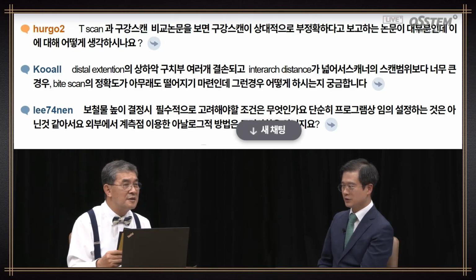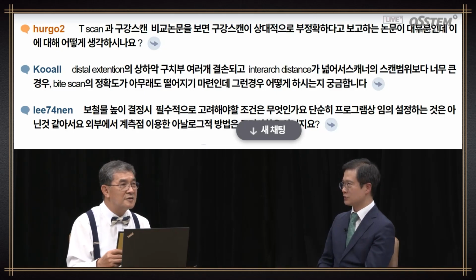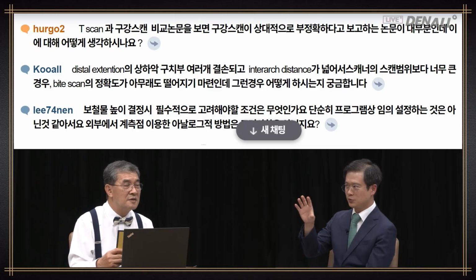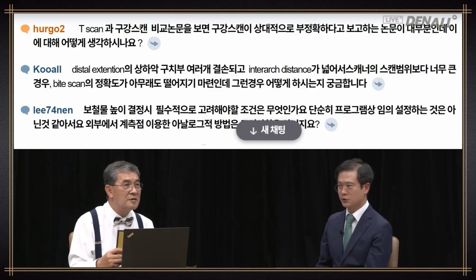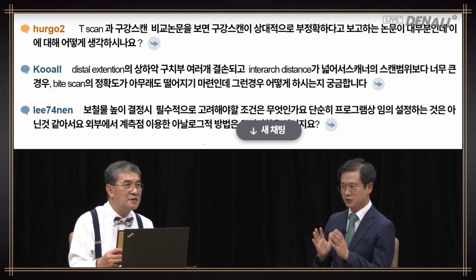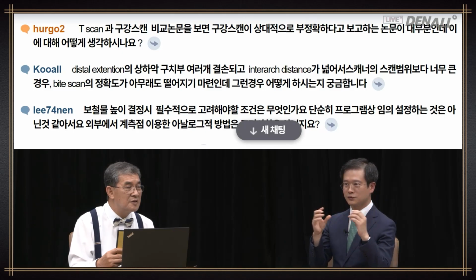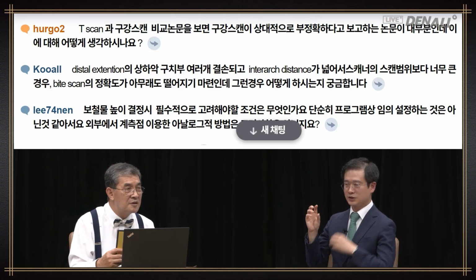I think this is a near edentulous case, a patient with only a few anterior teeth left. In this case, I do not take bite of the residual teeth. My principle is to scan full arch, both on the left and right. I get information with 8 teeth on left and right and upper and lower. But at times, this is not possible.